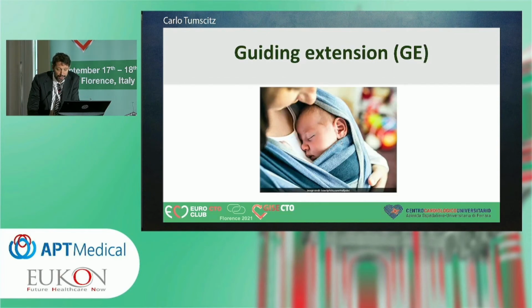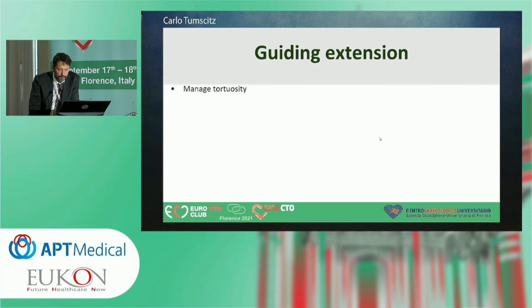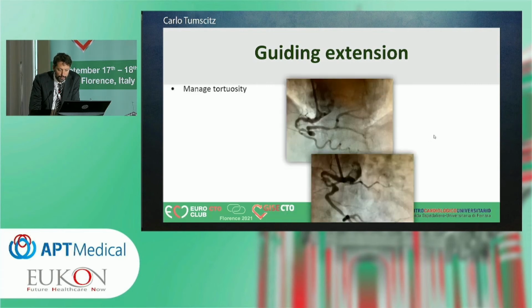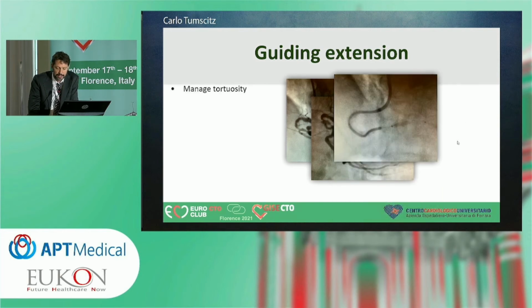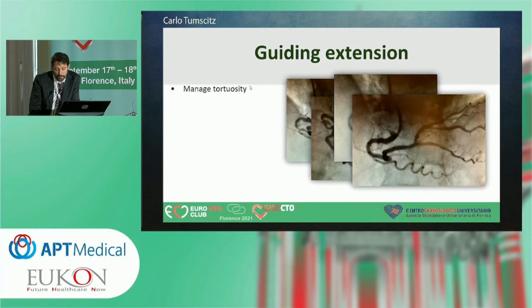Then I would like also to talk about the guiding extension from APT. That's another option that we'll have in the market right now. Obviously, I don't have to say more, but in the past, this kind of procedures would seem impossible. I think with the guiding extension, everything seems really easier, and we can do this with very good results and not much effort.